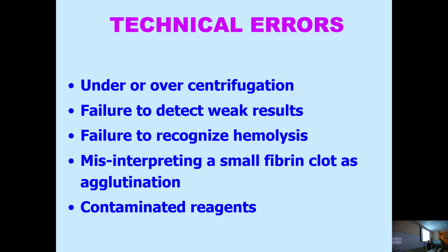I thought hemolysis was when it came out looking pink instead of clear with a button. Yeah, well, yeah. So you could have hemolysis if it starts with a normal yellow plasma and you put it with the cells and then your supernatant is pink, even with a button, like the ones we did on 12, we got rid of the button completely. I wiped out that button. But even with a button, you have to recognize that, oh, the plasma's pink now, and it wasn't pink when I first put it in there. So that's what you have to make sure you recognize.